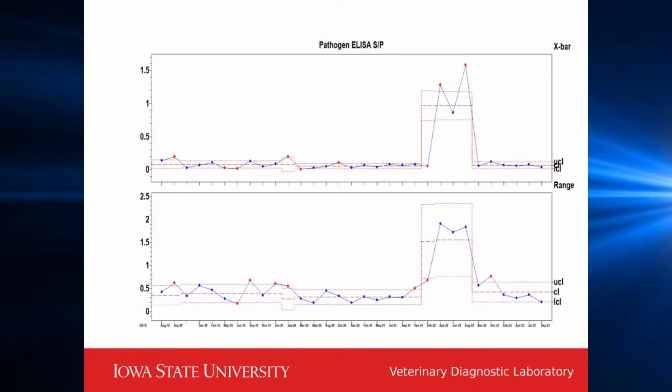And now we have another population of animals where the same things were experienced with a shorter history. The values on the pathogen ELISA at this time are showing a variation that's out of control. And this is something that we see on occasion in populations of females or pigs. This does not look like an antibody kinetic curve. I think we would all agree with that, but something from outside the population has been introduced into the population that produces a nonspecific reaction on this ELISA. The possibility of that is further borne out, I believe, by the range values.